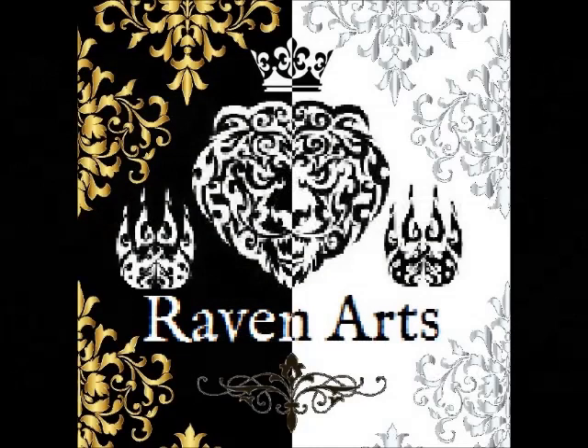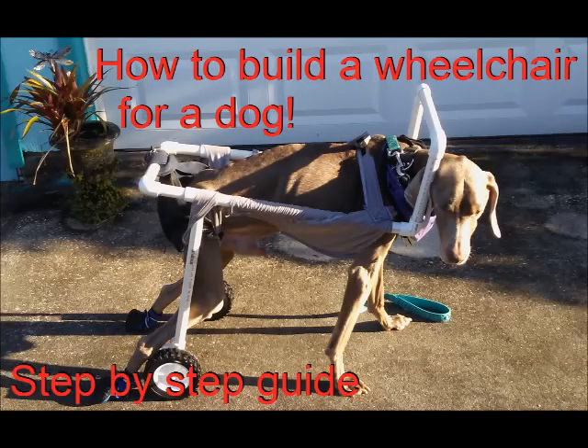Thanks to the support of people like you, I was able to create a wheelchair for my dog Wyatt. I thought that I would create a step-by-step guide on how to make one of these wheelchairs in case you ever need one for your dog.